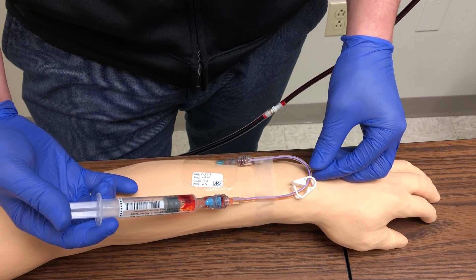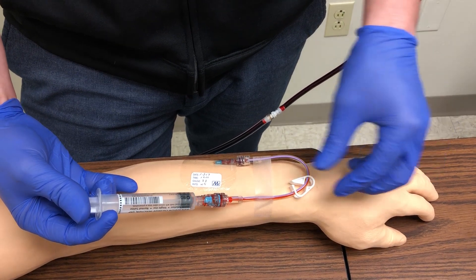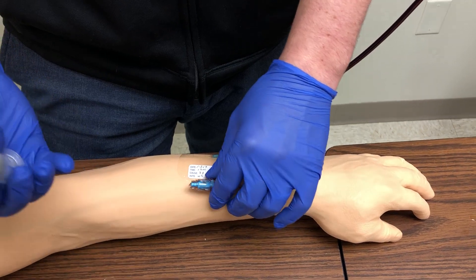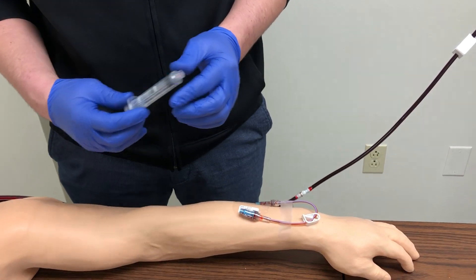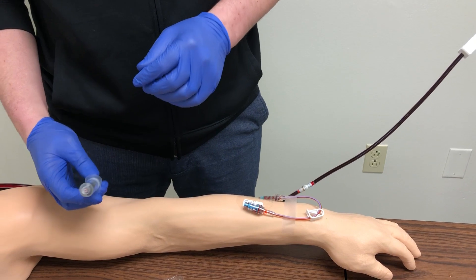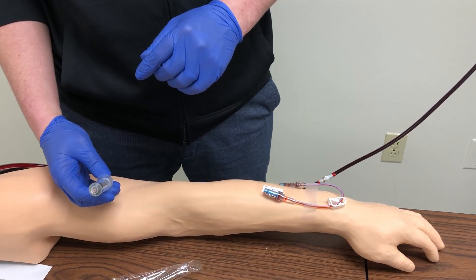After gently flushing the fluid through the IV catheter, we are going to lock the J-loop and then remove our saline syringe. We want to discard it appropriately, remove our gloves, perform hand hygiene, and then document in the EMAR as well as the IV assessment intervention that we performed the saline flush.